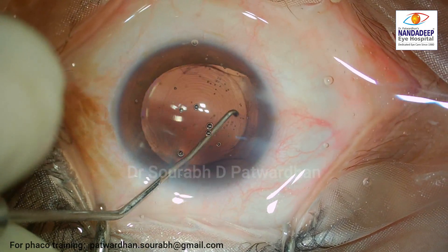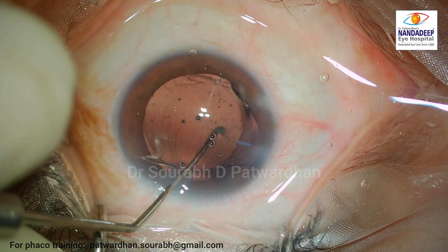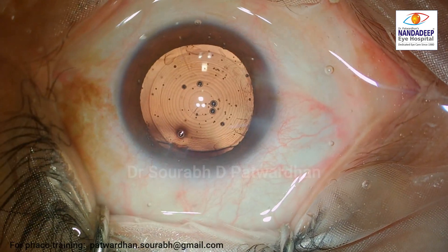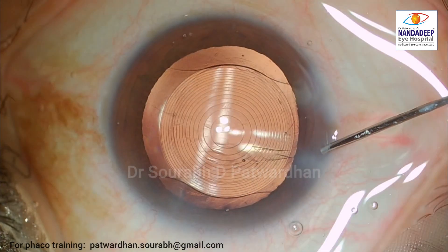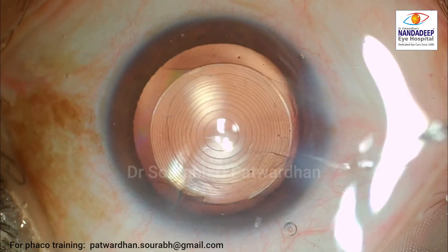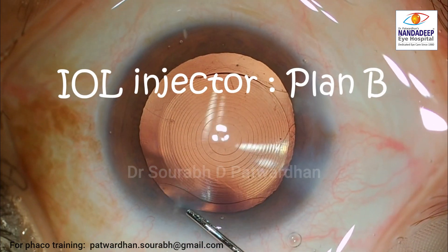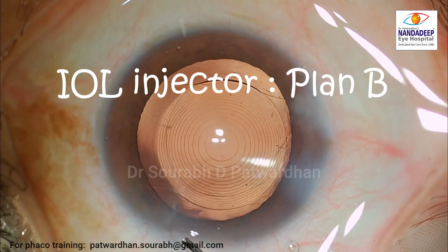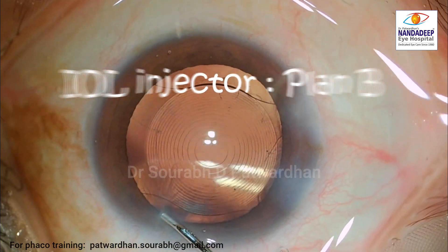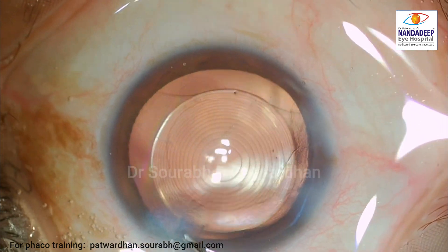While injecting with the cartridge, you must have seen that I was observing the plunger — it should be pushing the IOL and it should not go over the optic of the IOL. That should be carefully looked into. I am sure you must have also come across these issues when operating. Many times we have issues with the injectors and cartridges — sometimes they don't work well, and we may have to use a different IOL injector or cartridge.